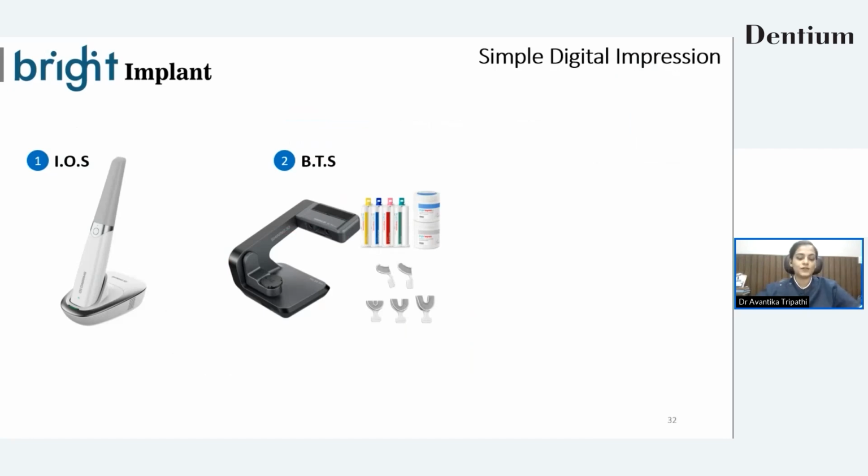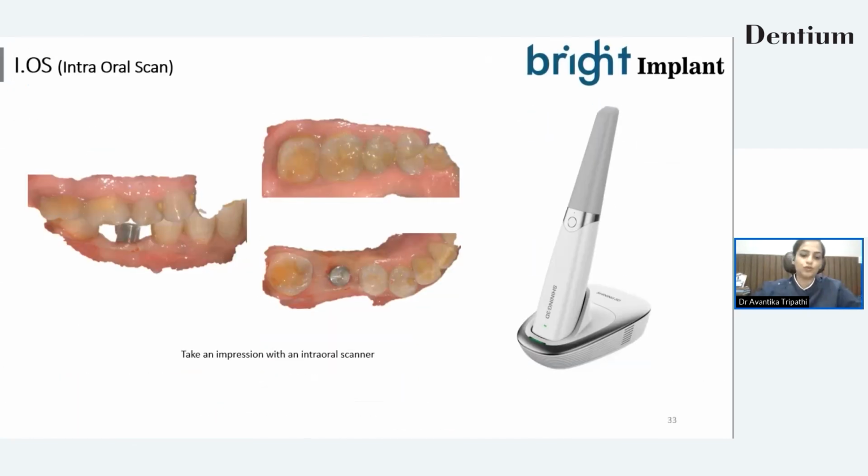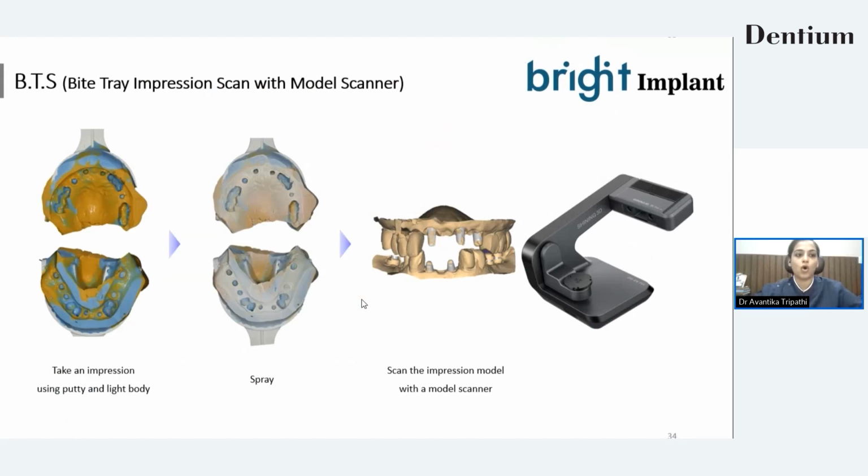First, we are going to discuss the intraoral scanning method. First I'm going to scan my abutment with the help of the scanner.